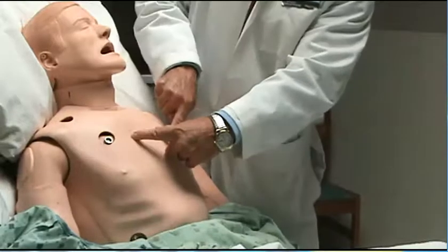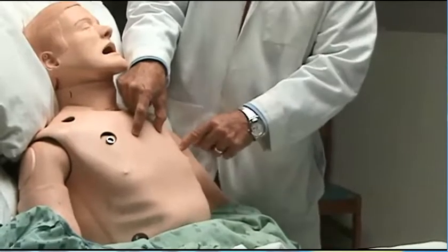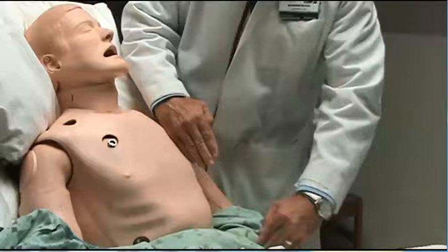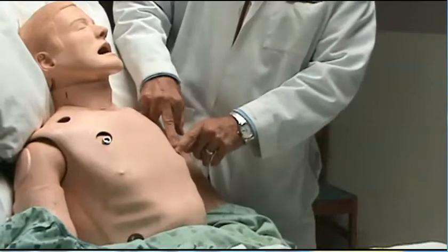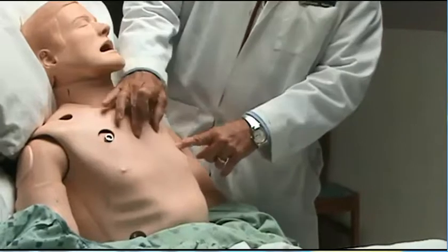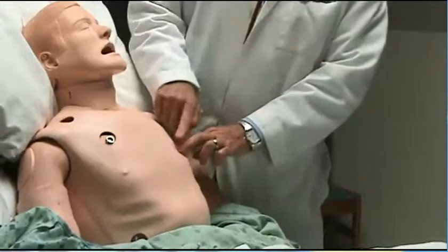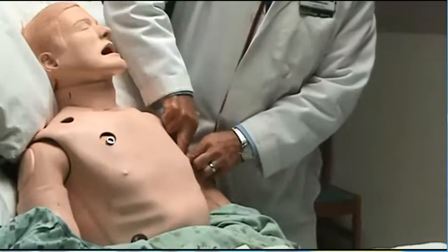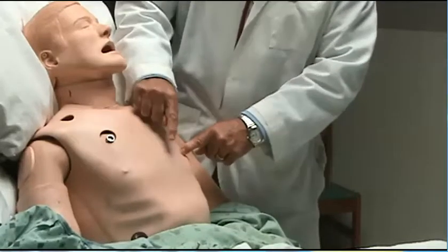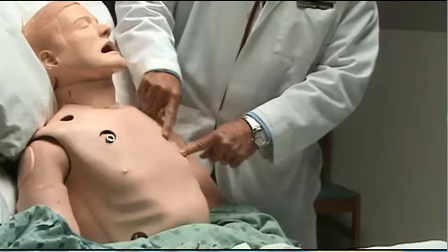That's crucial — V1 and V2 have to be right next to the sternum. Now the next lead you put on is V4; skip V3 for a minute. You put V4 right in the mid-clavicular line, which is a line from the middle of the clavicle heading straight down. It pretty much lines up with the nipple, but obviously depends on whether it's a man or a woman. That should be in the fifth intercostal space. A lot of people want to come way down with their leads, but that's going to give a false reading. Now where does V3 go? It goes right on a line smack dab between V2 and V4.